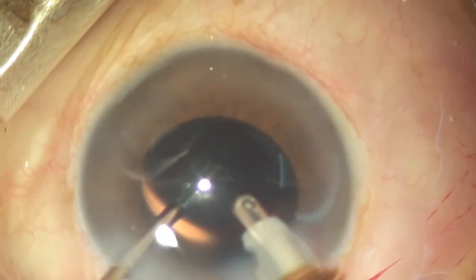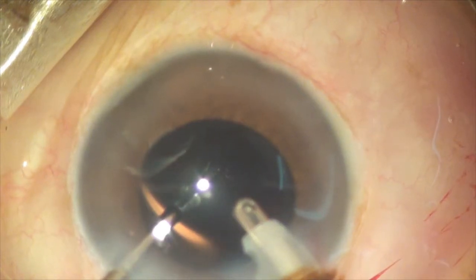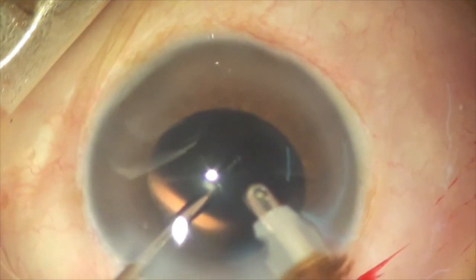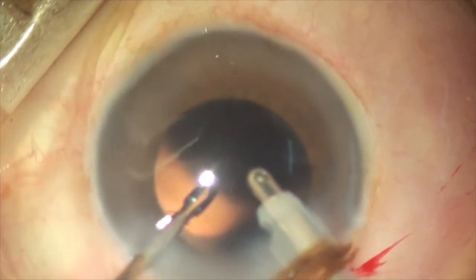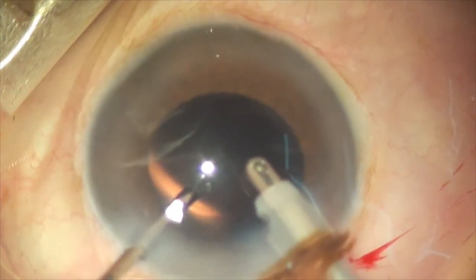You can see the irrigation-aspiration probe inside the eye. As I am grasping it, the PCR has become triangular and slightly bigger. But don't give up. You can see the horizontal corneal marking on the surface of the cornea. So I re-grasp the flap that is floating inside the eye.